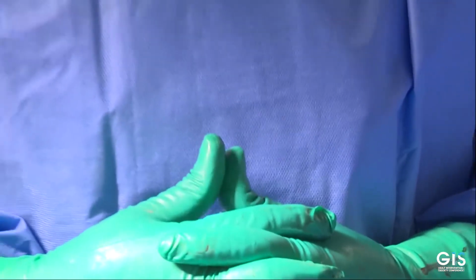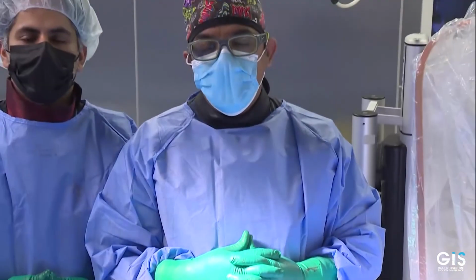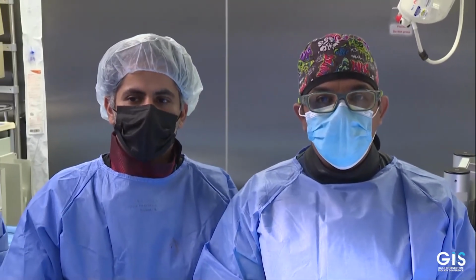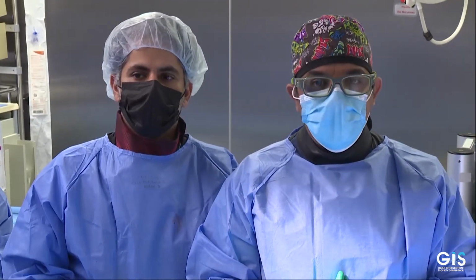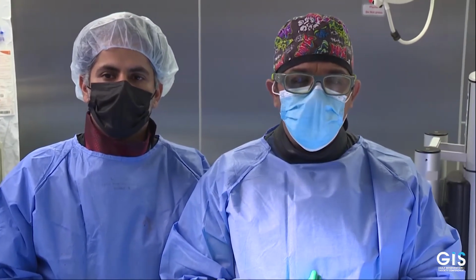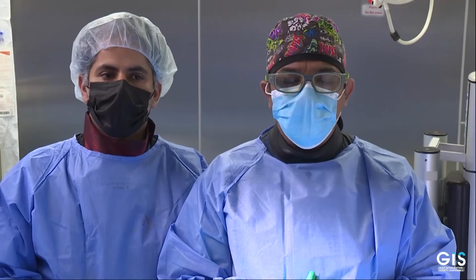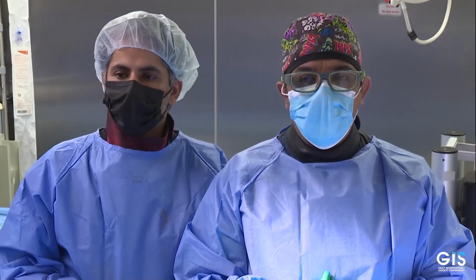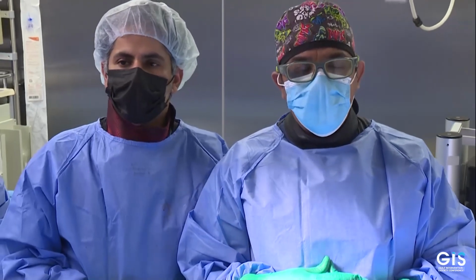Thank you. We conclude our case today. It was a challenging case in many aspects. Number 1, the tortuosity of the aortic artery and the significant degree of calcification. Number 2, the patient has a spinal problem with the spinal fixation before at the lumbar spine that didn't allow us to get a very good angle, as the patient had to lie on a wedge throughout the case.